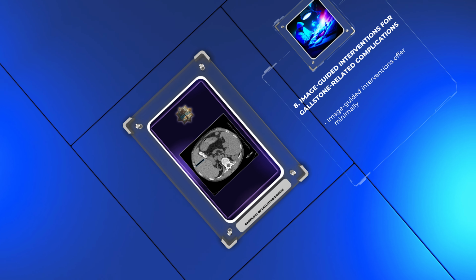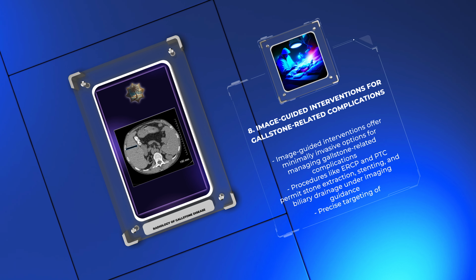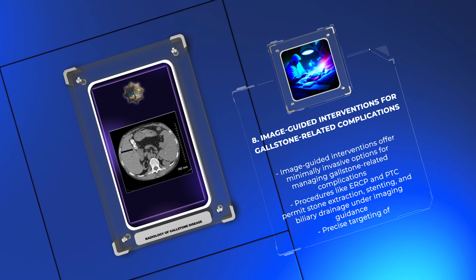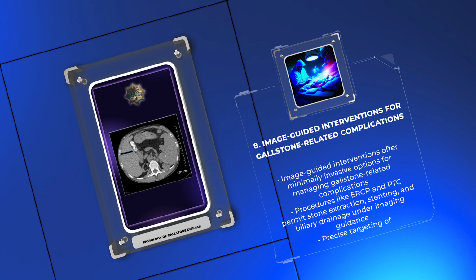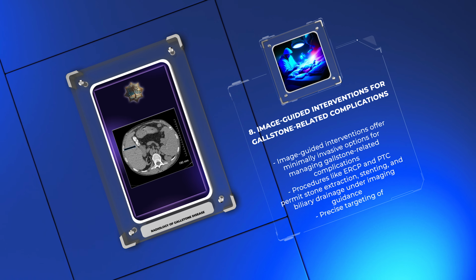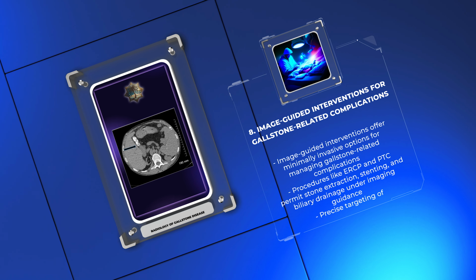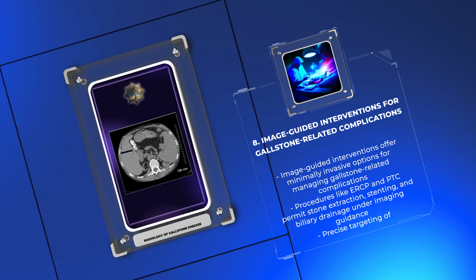Professor, image-guided interventions have revolutionized the management of gallstone-related complications, offering minimally invasive options for patients. The professor showcases images of interventional radiology procedures, such as gallstone removal using endoscopic retrograde cholangiopancreatography, ERCP, and percutaneous transhepatic cholangiography, PTC.